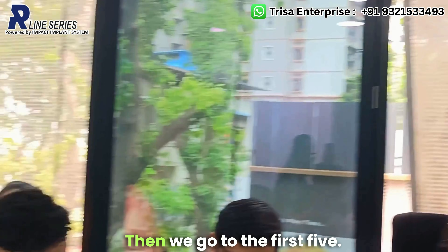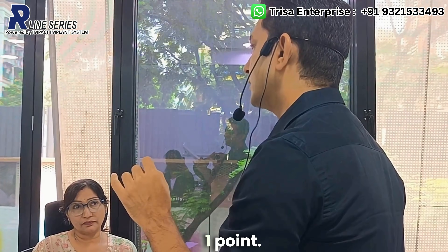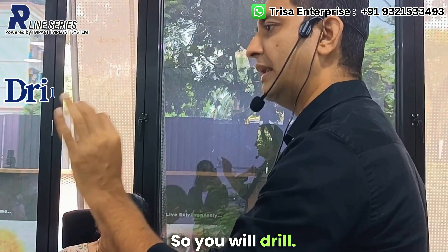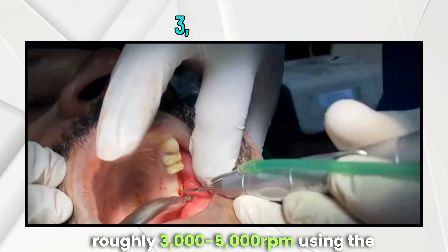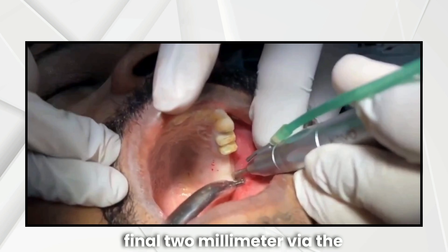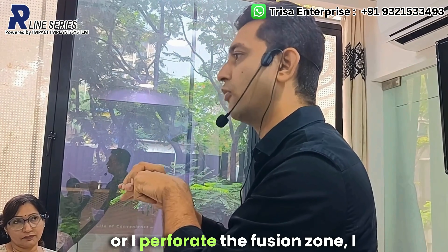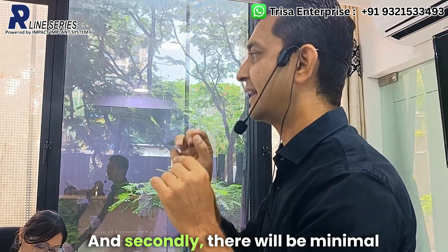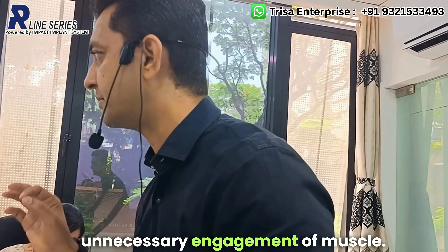The next step is to drill using the 1.8 mm drill from the Impact R-Line kit at roughly 3,000 to 5,000 RPM using the straight handpiece, focusing on the final 2 mm via the channel created by the C finder. When you perforate the fusion zone, look for two things: the drill should come out with clean white bone, and there should be minimal bleeding from the osteotomy, confirming no unnecessary engagement of muscle.